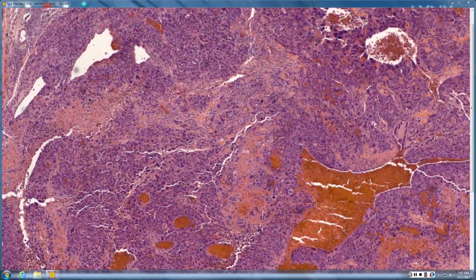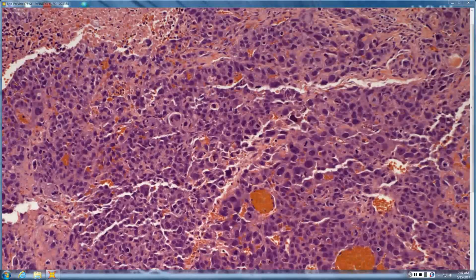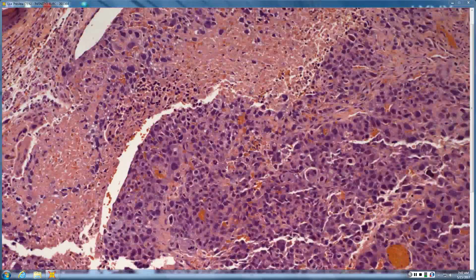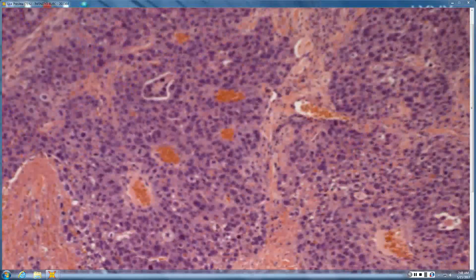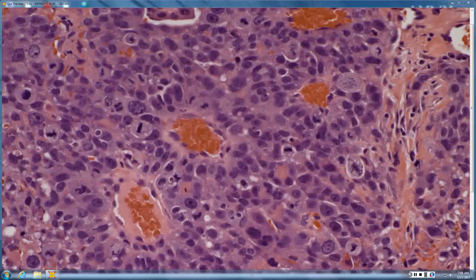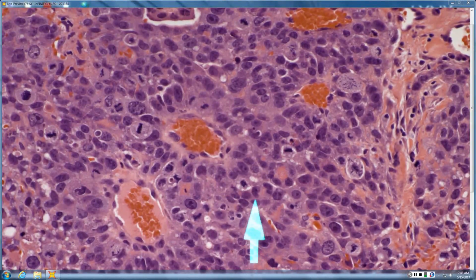We've got a diffuse atypical infiltrate. It's not particularly screaming glandular. There's still some cytoplasm, and when you look at the cytoplasm, see how that's all one cytoplasmic unit and yet there are multiple atypical nuclei in it? Yes, so it's like a big syncytial giant cell.